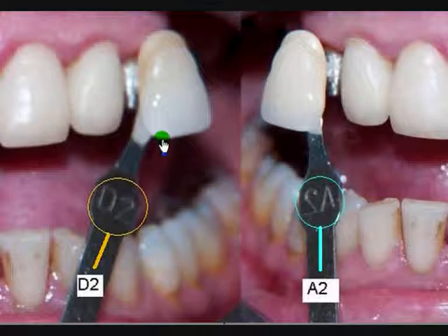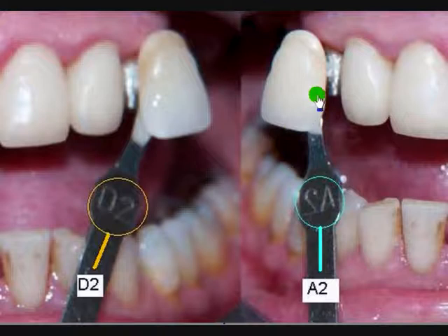It seems to be evident that the value of the D2 is lower compared to the value of an A2, and this is not just a matter of how the light is absorbed or reflected in the case. Compared to the antagonist, I do like the way this lower value of the D2 integrates with the natural teeth.